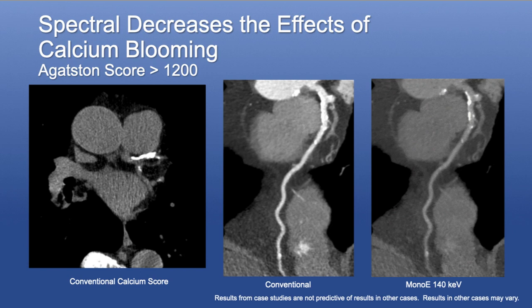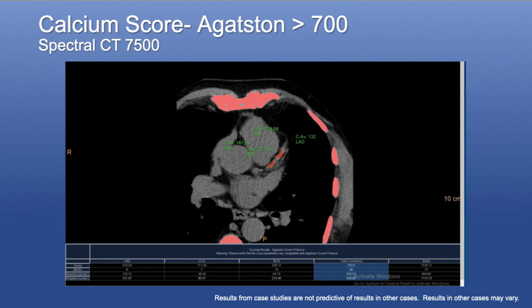Sometimes it's hard also because not all calcium scores are the same. If you have calcium that is more concentrated in one vessel, in one area, maybe your radiology techs have certain cutoffs that you're telling them where they should scan or they shouldn't, if you just use that cutoff, sometimes you may end up with patients that the calcium score is not that high, but it's all concentrated in one region. So in this way as well, you may be able to salvage those scans.